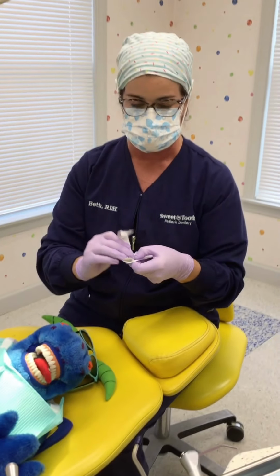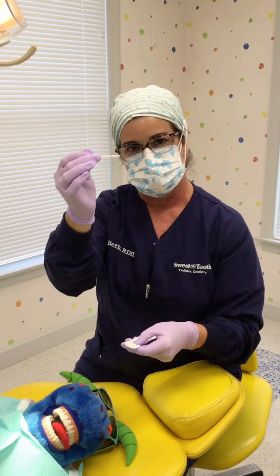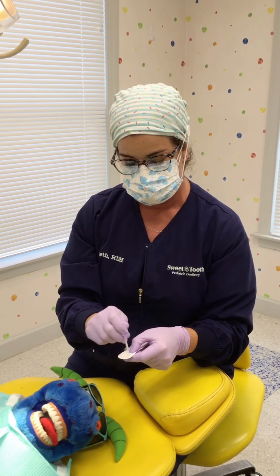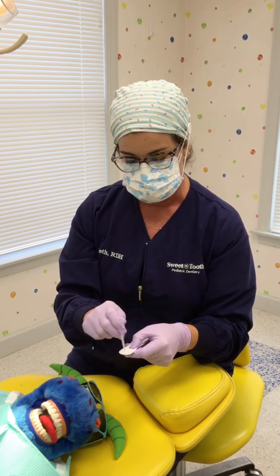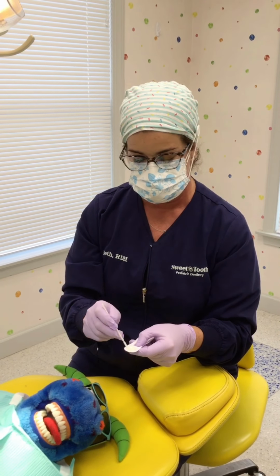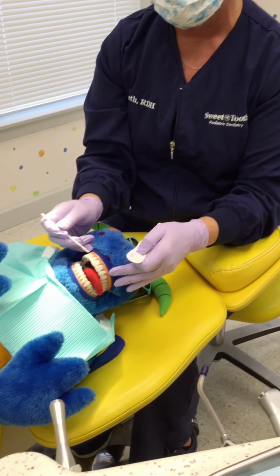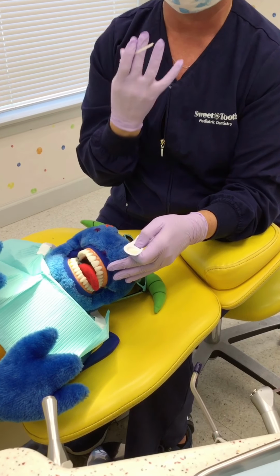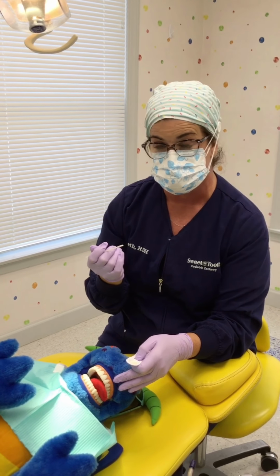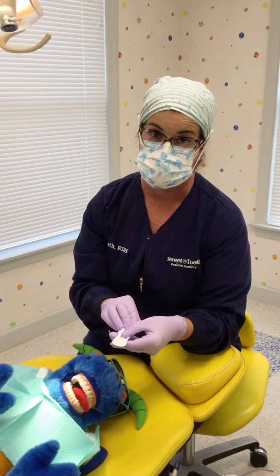is we get to paint your teeth with a really special kind of paint. There's a little tiny paintbrush that's in there. And then what we're going to do is we stir up this, what we call varnish, but it's like a special vitamin. So it's all stirred up in there. And then we just use that little tiny paintbrush and we just paint around on your teeth so that it leaves them feeling a little bit sticky, but yet it helps cover them and protect them with our fluoride. And the fluoride's a really special vitamin for teeth to help keep them strong and keep them healthy.